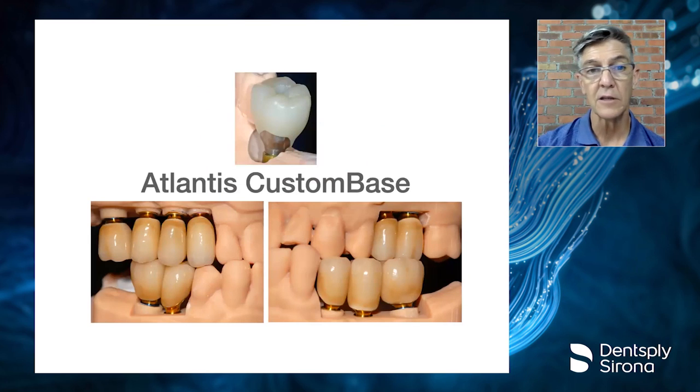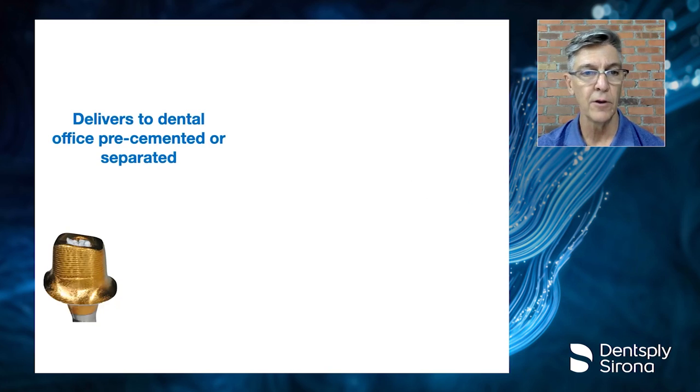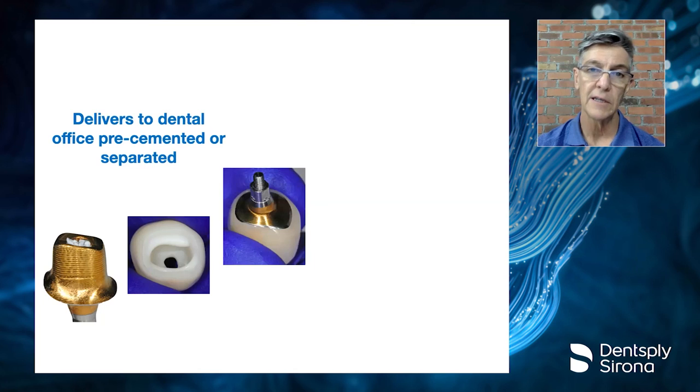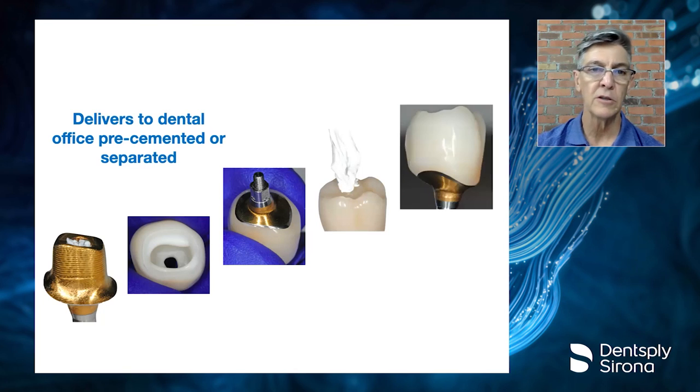And as far as the clinical flow, when it comes back to me, whether it's a single unit or a very complex case, it's actually not complex because everything is still a single unit. So one or 11, it's the same thing. And what I like to do is get the abutment, place some obturation medium into the access hole. So a little tape is placed. I place a very small amount of temporary cement onto the crown or into the crown, seat it, remove the excess, remove my little tape packing, and then go to the patient and do a try-in.